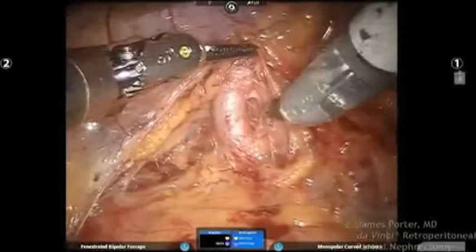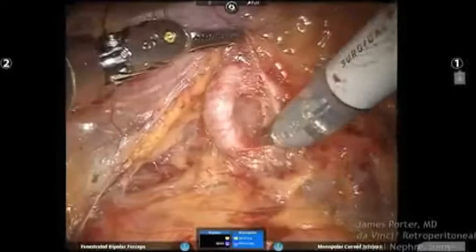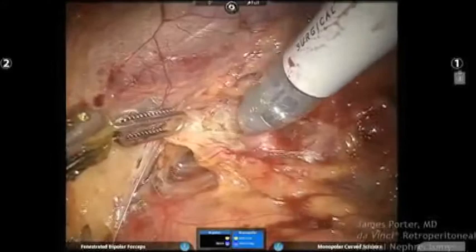So we're just getting this artery dissected out. Jim, any preoperative preparation, as far as you gave us the demographics and the history on the patient? What about preparation of the patient? Do you do any, you know, some people will bowel prep, some won't. Anything special that you recommend? Yeah, we bowel prep our transperitoneal patients, but we don't bowel prep the retroperitoneal patients.